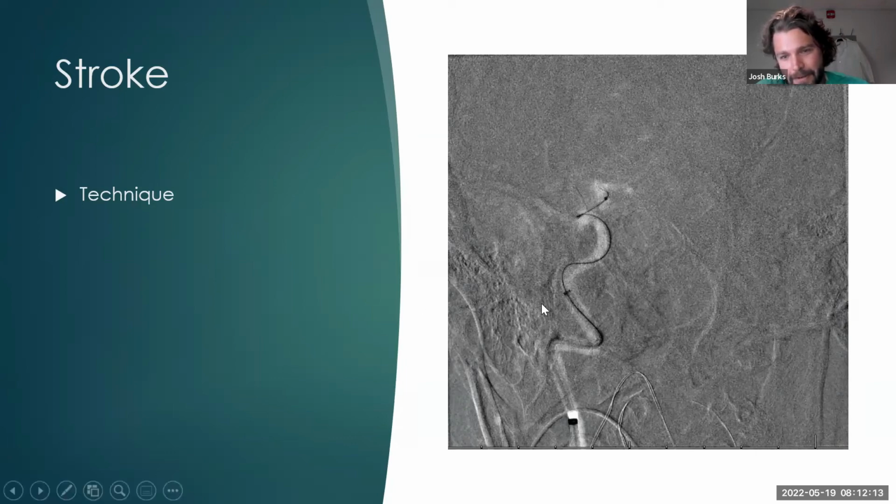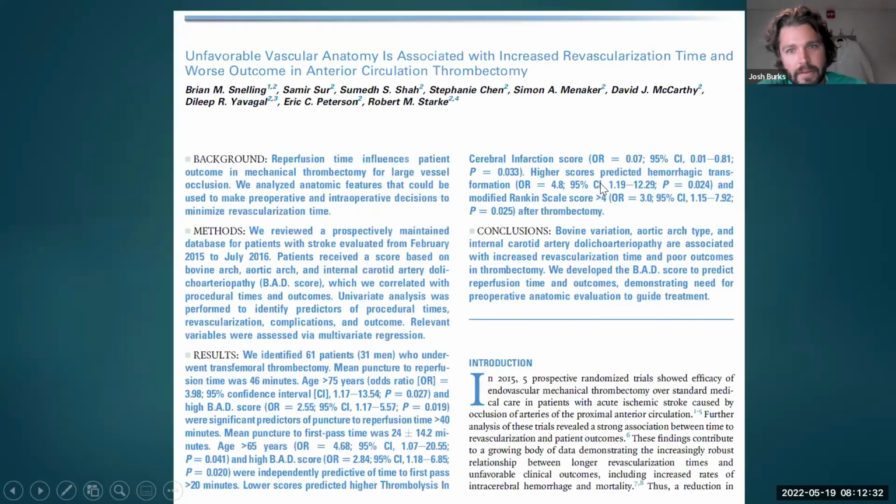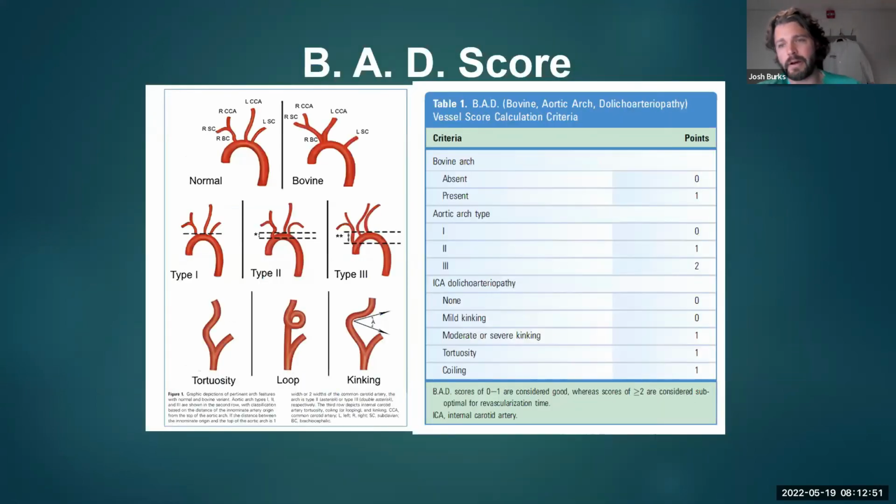And then you're going to have an intermediate catheter, which for strokes is an aspiration catheter, and I'm going to go over what that means. There's then a smaller microcatheter, which is how you get out to things more distally, and this helps you bring up some of these larger catheters, and then you've got a small wire here that you're driving. One thing that's been published on extensively by the group here is using radial access when necessary, femoral access when necessary, and using these things to reduce the amount of time it takes you to get to a clot.